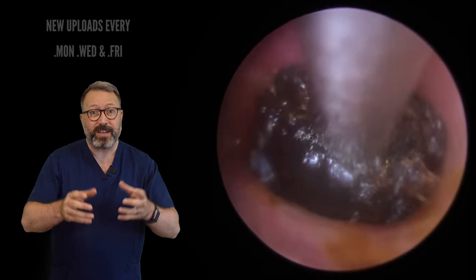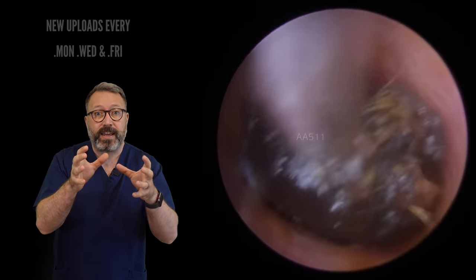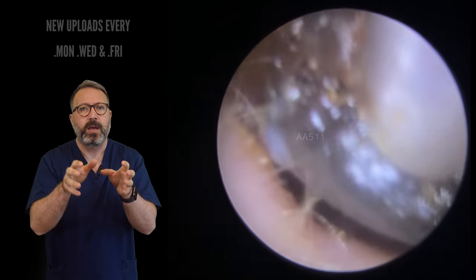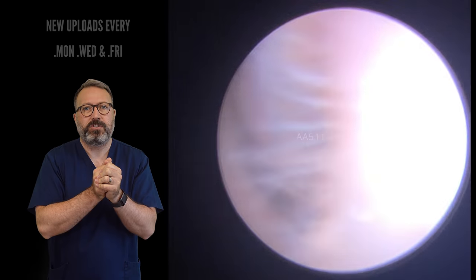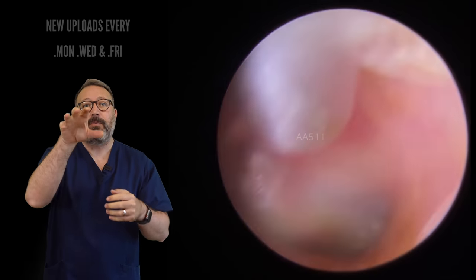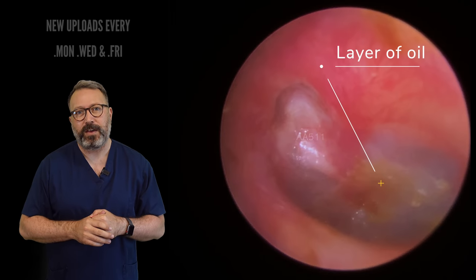It's really starting to come away, starting to come down. We can see that dry white skin on the left-hand side coming away there. It's really getting some movement to it. Out that's come from just in front of the eardrum! Oh my goodness — this patient was so relieved that had gone. As we take this away, it gets a little bit stuck on the outside edge and we've just got to manoeuvre it a little bit. I was so glad to get this out — I actually forgot to video it coming out of the eardrum, I'm so sorry. But when you take a look behind it, there's the eardrum. There's a little patch of oil there — just a little layer at the base of the eardrum — that will come away with the next bath or shower.